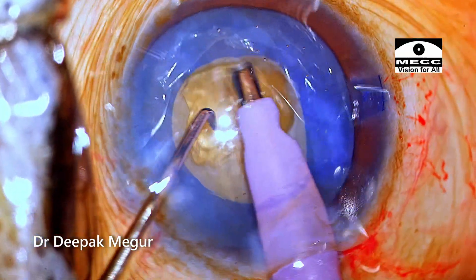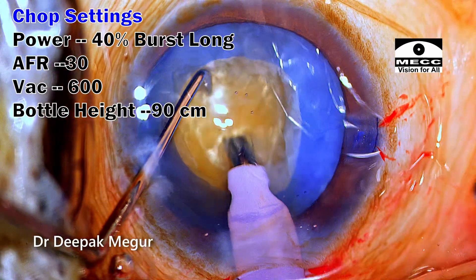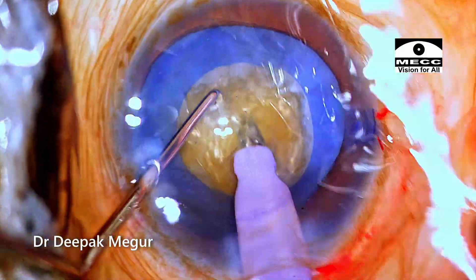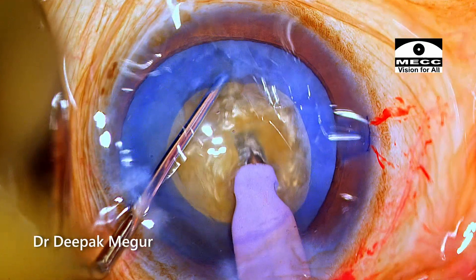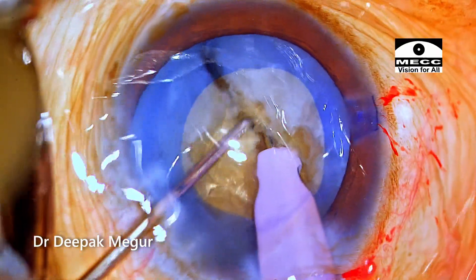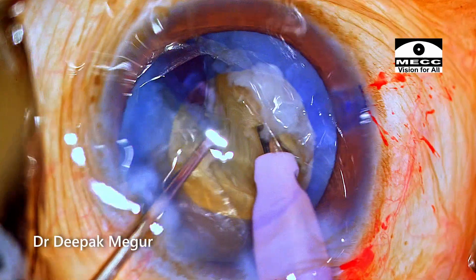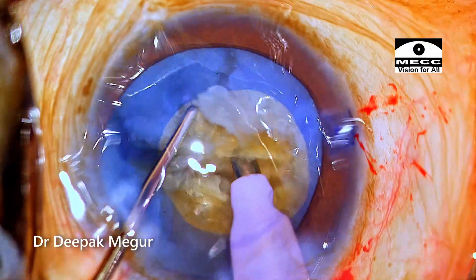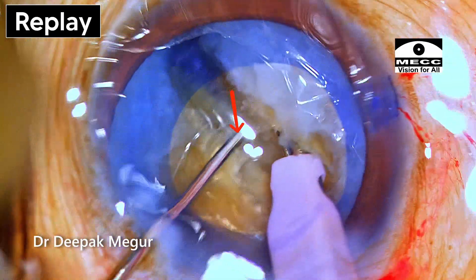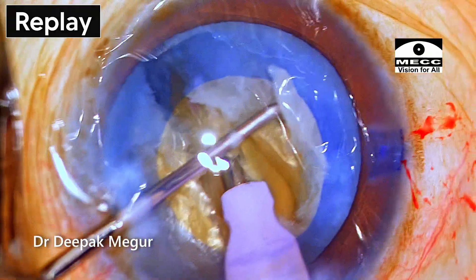Once the superficial epinucleus is aspirated, it's time to chop the nucleus. The patient has deep-set eyes with a lot of pooling of fluid, which is being aspirated actively by my assistant. The tip is buried into the nucleus. Retrospectively, the burying was not deep enough, and during vertical chopping there is a slight torque. Nevertheless, the nucleus is split at least in the distal half. The chopper is then progressively placed at deeper planes, requiring a couple of attempts to achieve a full-thickness crack. During lateral separation, because the chopper is placed at a deeper plane, pressure is not exerted at the rhexis margin.